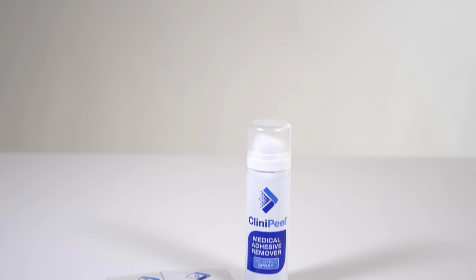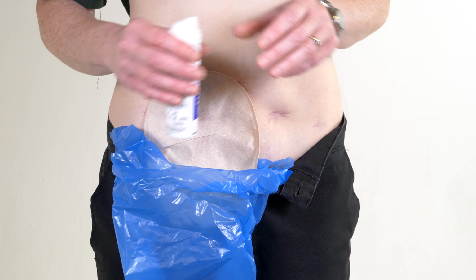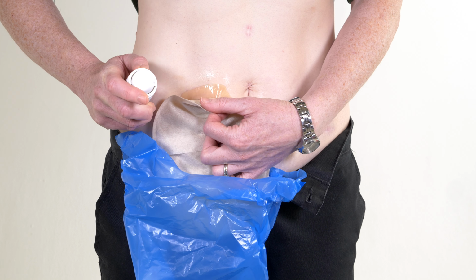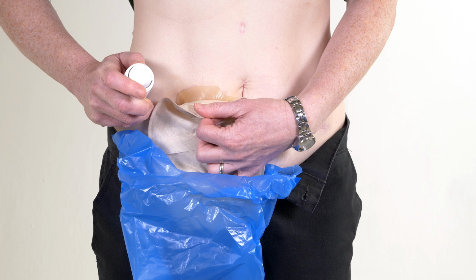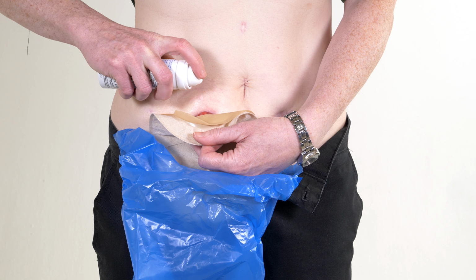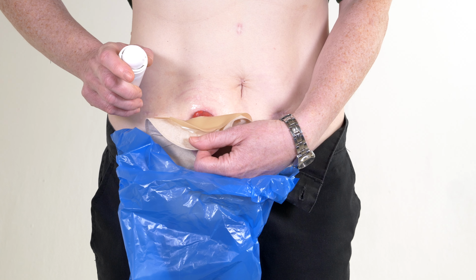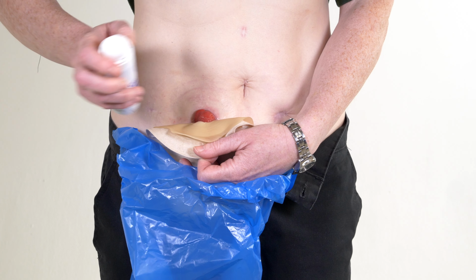A medical adhesive remover can help take off your pouch gently, without pulling or irritating the skin. Apply a small amount of adhesive spray or wipe around the top edge of the flange and wait a few seconds for it to loosen. Start from the top and slowly peel the flange away from the skin. Hold your skin taut with one hand to make it easier and more comfortable. You can use more adhesive remover if needed as you go.